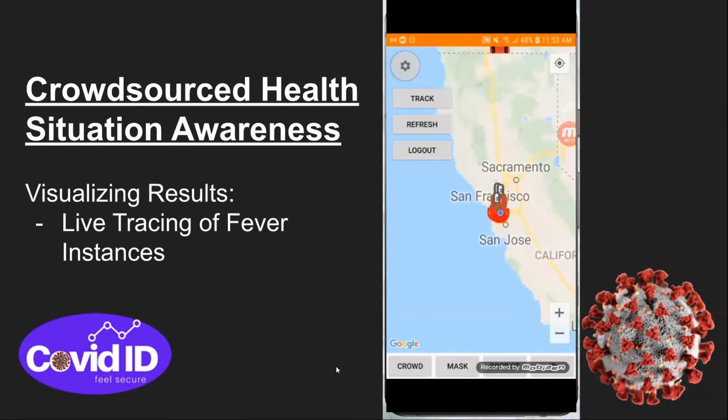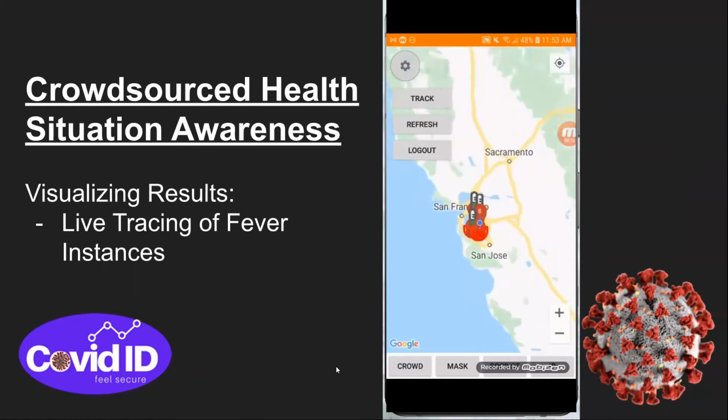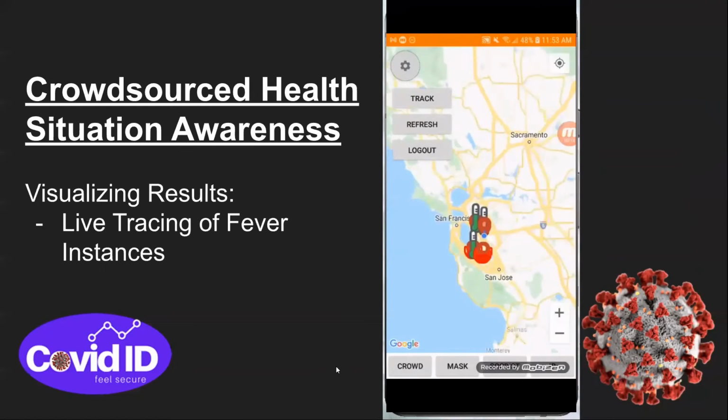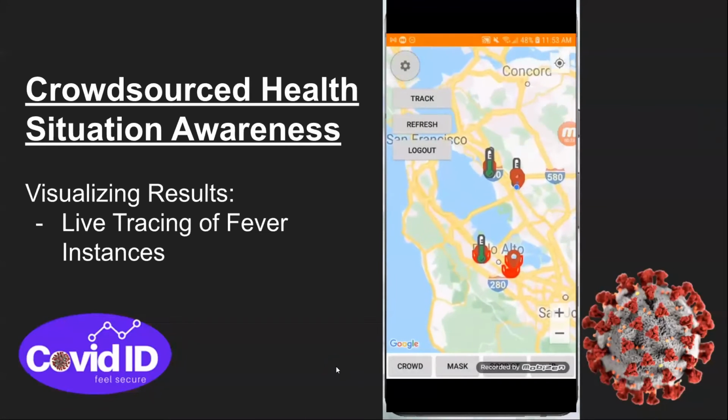These records are critical, as the next part of the COVID ID system involves consolidating the data from each record and using them to populate a Maps interface so that users can visualize and avoid areas of high risk.